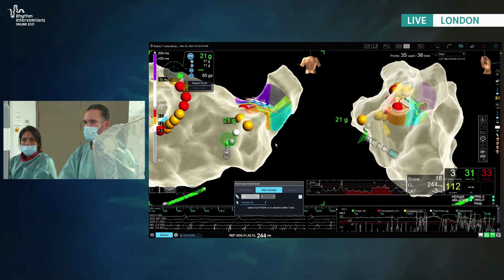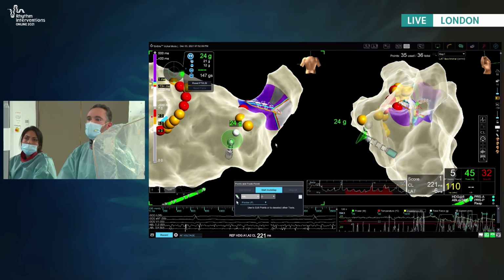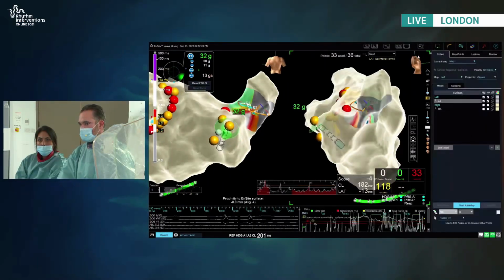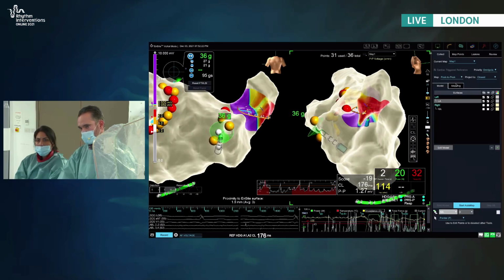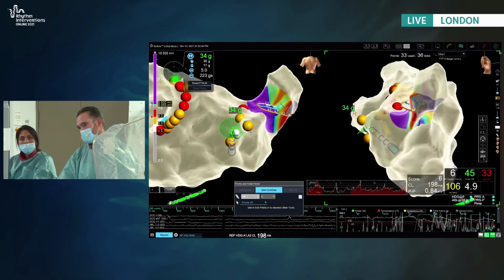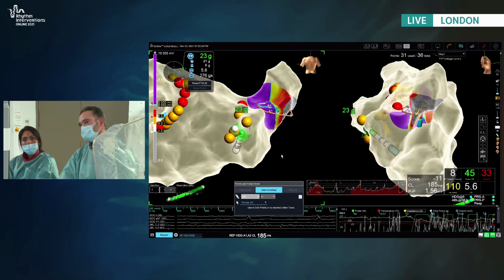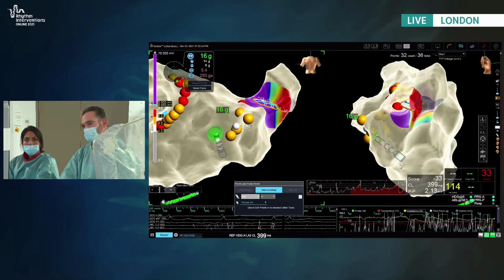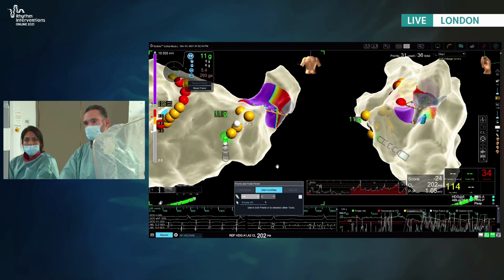Yeah, and you said you had something to add. No, I'm sorry, I didn't want to interrupt. I was just going to add on and echo what Hugh was saying earlier, because I think these technologies, we all love them and we all want to embark on them. But before we embark on them on a large scale, we do need to do the trials, and we must not let the industry off the hook. I think we need to have good outcome trials.